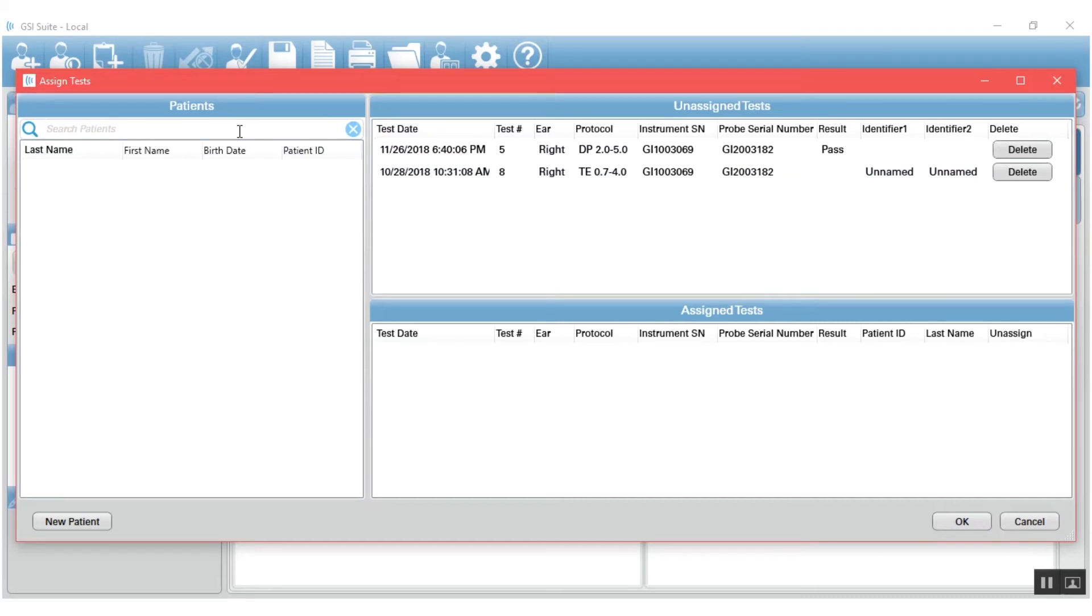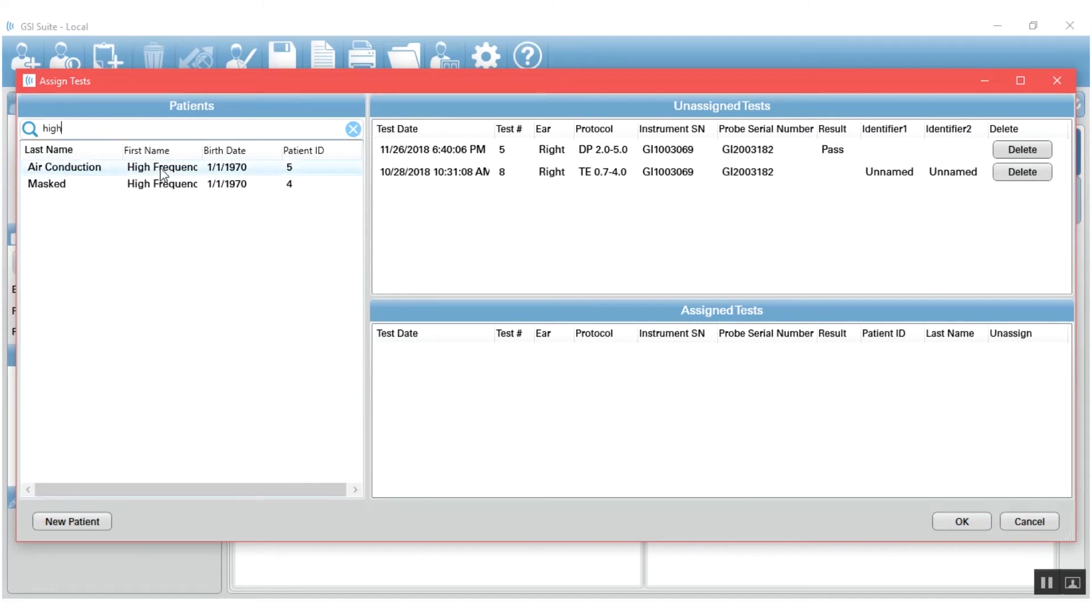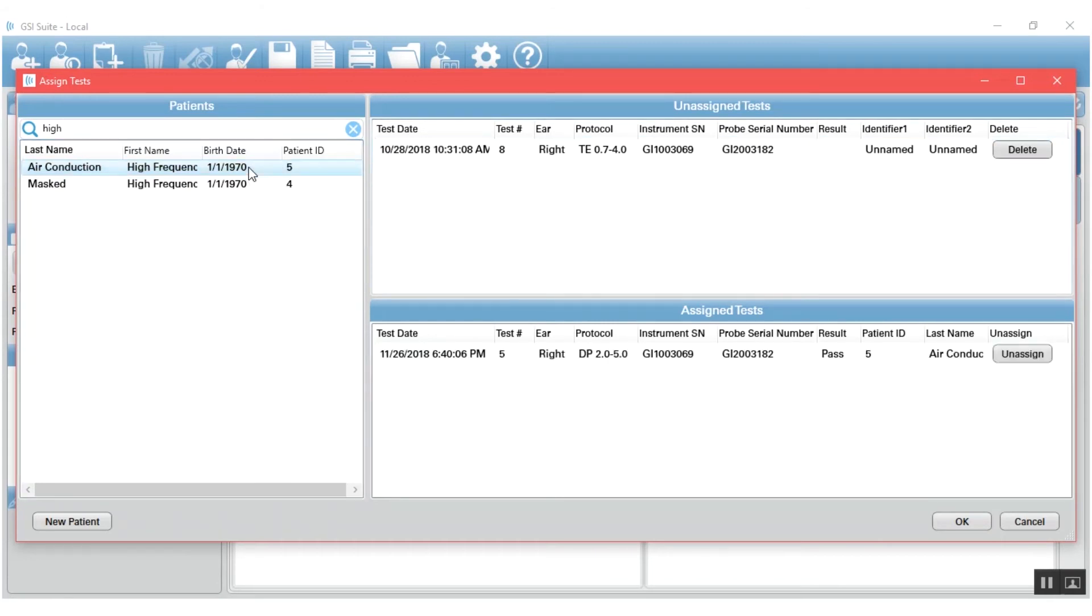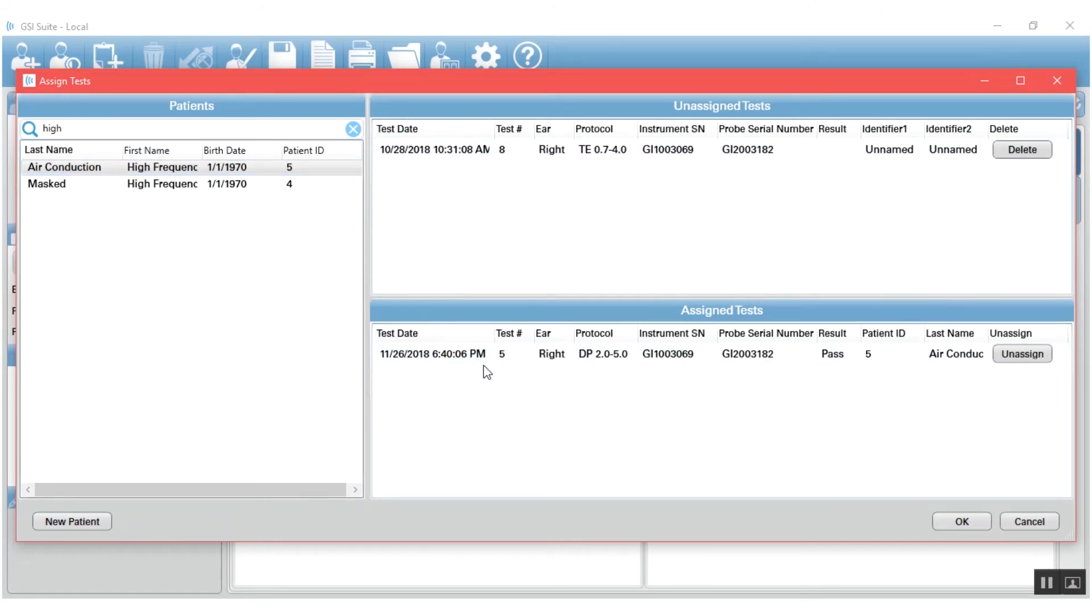When you're ready to transfer the patient, what you'll do is go over to the patient window and you can search for a patient that is already in your database, such as this guy, high frequency air conduction. You can simply click and drag that result to the patient and drop it on, and notice that that result moves down to the assigned test area.